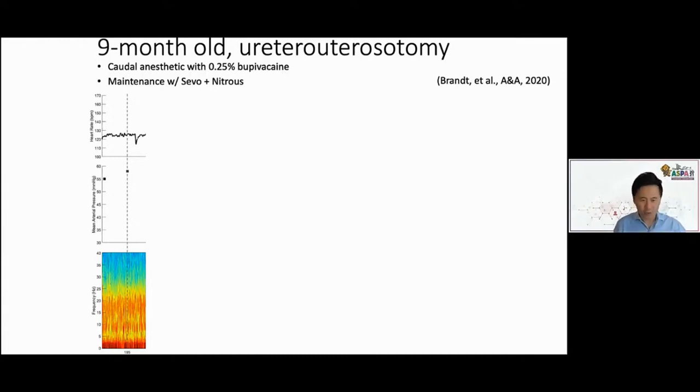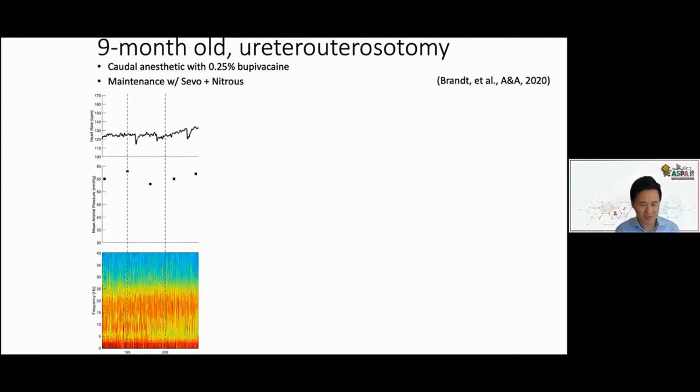Okay. And then of course, at this point in the anesthetic, maybe the surgery would be ending soon, but actually for this case, the surgeon needed to continue working. There was something they discovered that caused them to need to extend the procedure and do some additional work. So the case is going on. And of course, maybe there might be a worry that the caudal anesthetic is starting to wear off. So let's just scooch forward about 10 minutes.